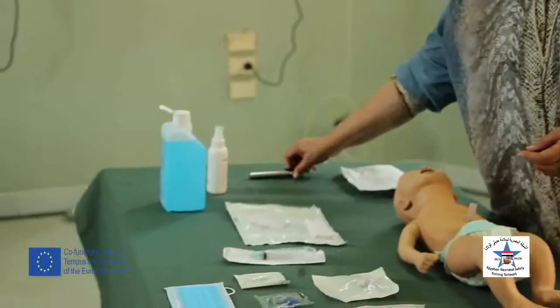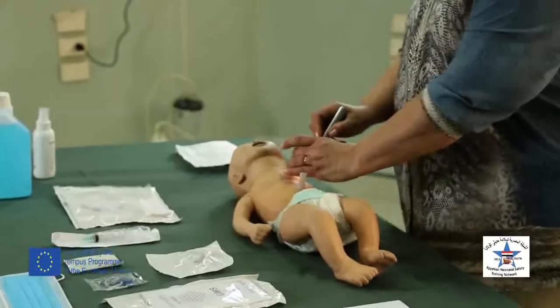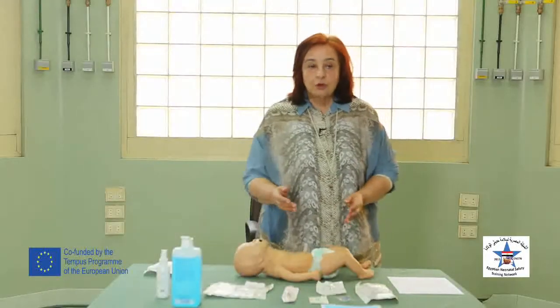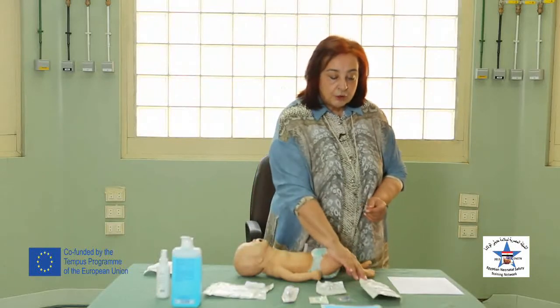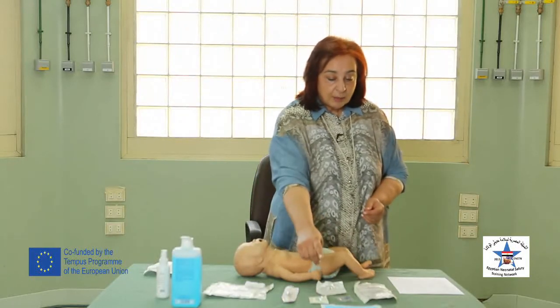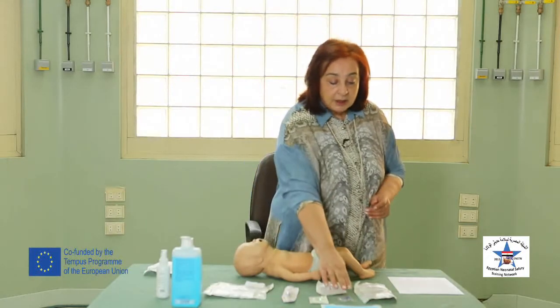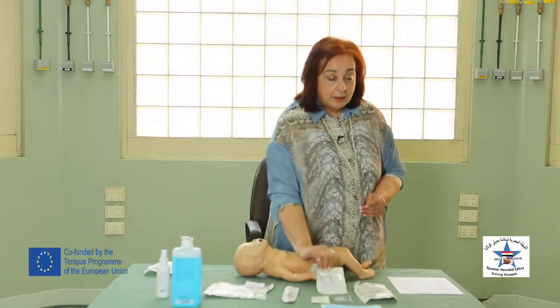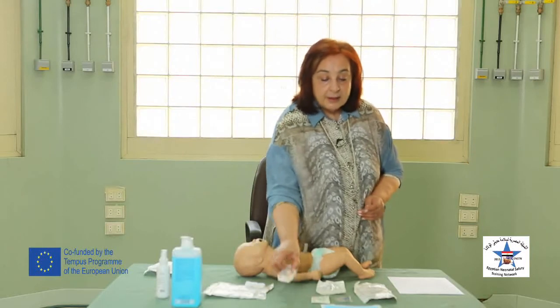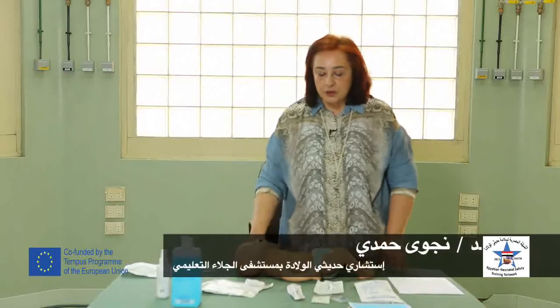If we do transillumination, we will find that there is a positive test on the affected side. The equipment needed for needle aspiration: we need a surgical glove, we need to wear a mask, we need a hygienic hand wash, and we need a butterfly needle, a 3-way connection and a 10 cc syringe. Now we will start to perform the procedure.